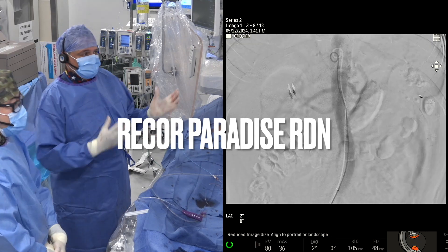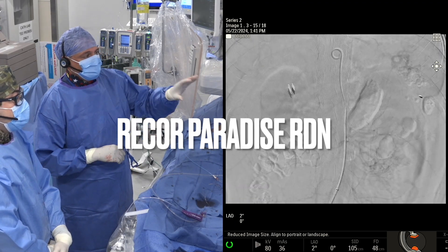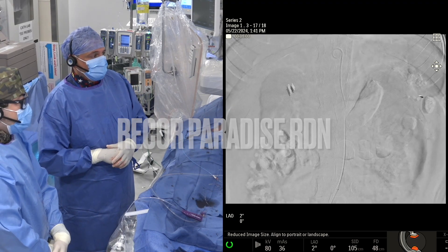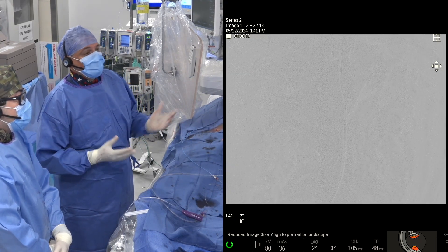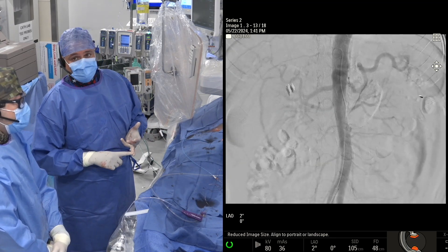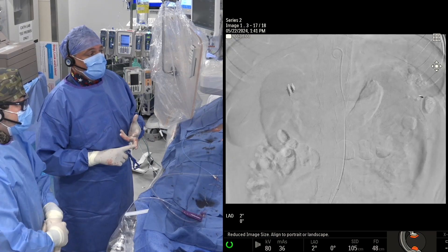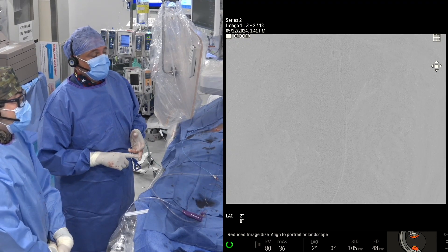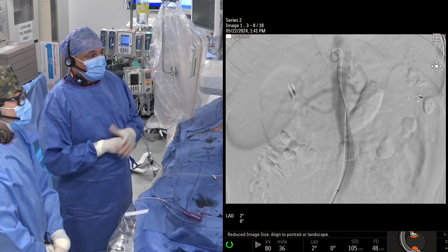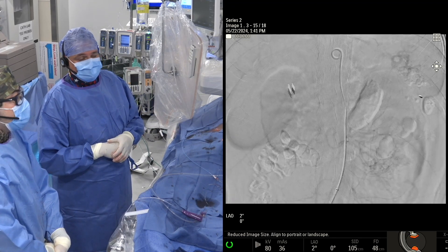The pigtail catheter is placed to the level of the diaphragm and contrast is injected to visualize the renal arteries and the parenchyma. This is to confirm the location of the artery, look for any atherosclerosis of the renal artery, identify how the vessels are configured, how often they branch, and what the caliber of the vessels are.